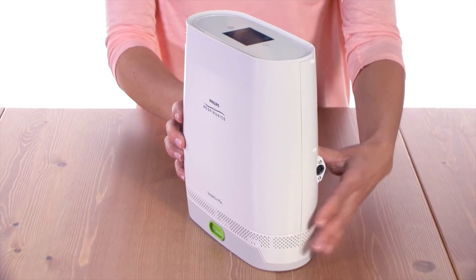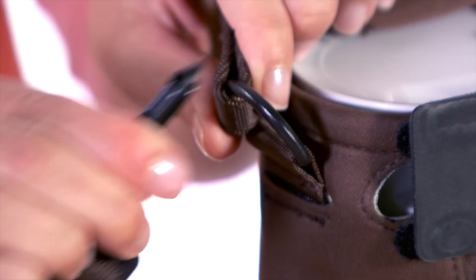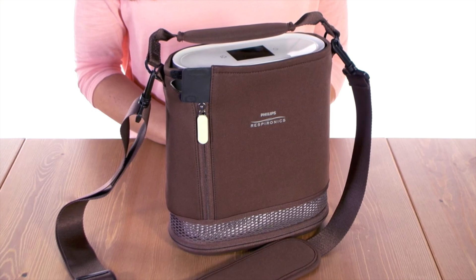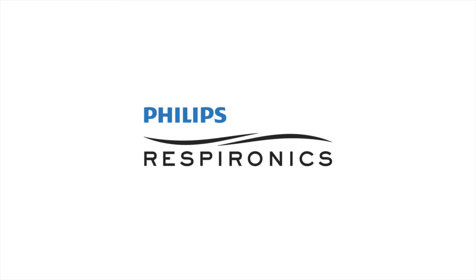On the opposite side, there is a power input connector. For convenience, the device comes with a custom carrying case. Simply attach the shoulder strap and you're ready to go. Innovation and you — Phillips Respironics.